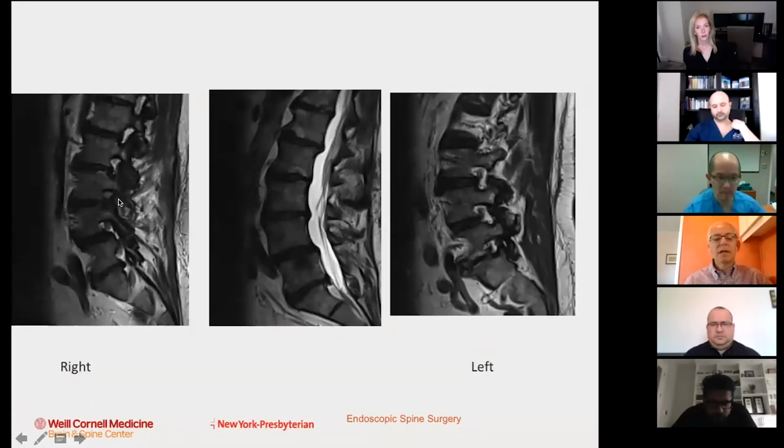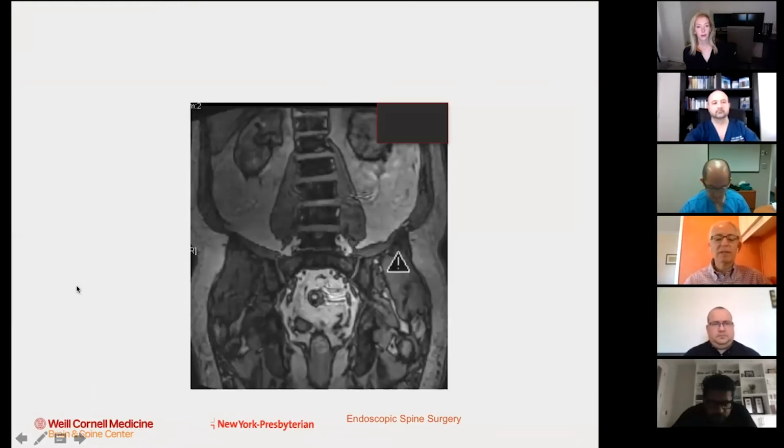So it's not surprising that a laminotomy did not help his pain, because it's very hard or nearly impossible with a laminotomy, or what we sometimes call a foraminotomy, which is really a lateral recess decompression, to decompress pathology that's truly in the foramen, as in this case.